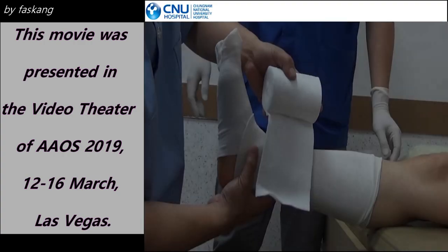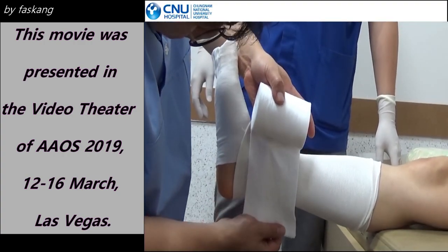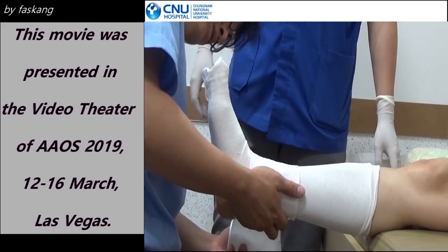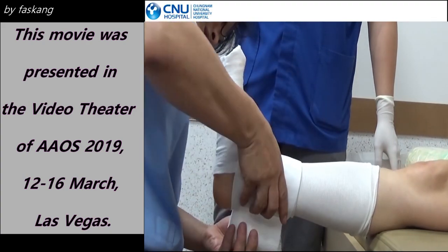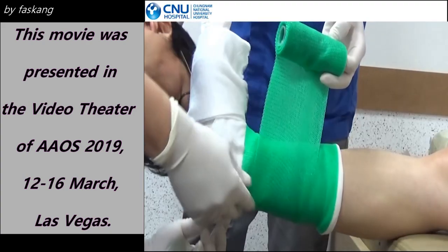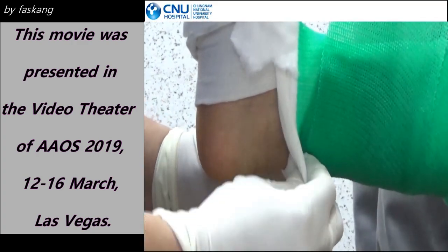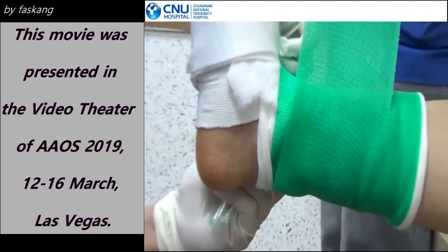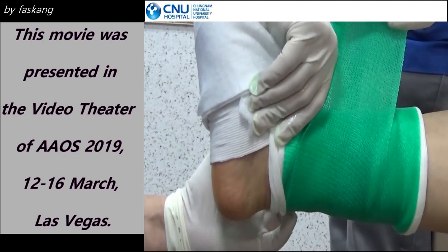This procedure demonstrates making a C-type open-heel cast. Most of the procedure is the same as K-type, though the difference is covering the most prominent portion of the medial and lateral malleolus and exposing the posterior superior portion of the calcaneus. C-type can be used for all foot and ankle fractures except pilum fractures, posterior malleolus fracture, lateral malleolar fracture undergoing conservative treatment, and toe fracture.